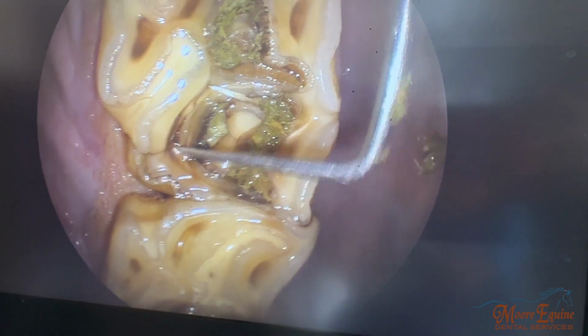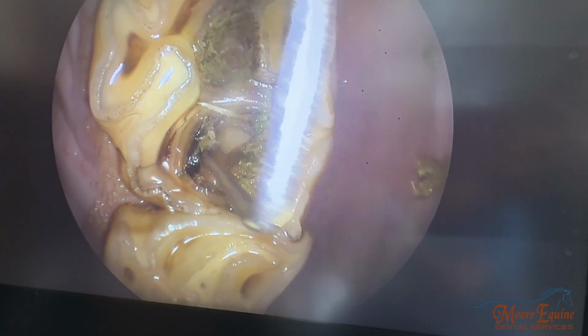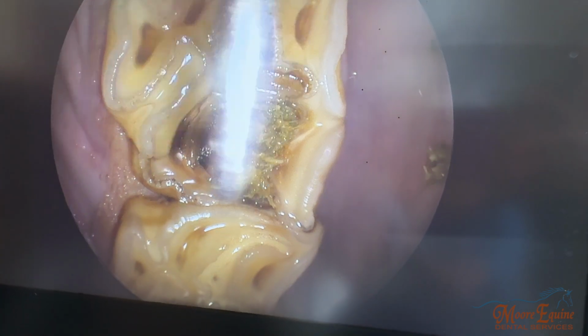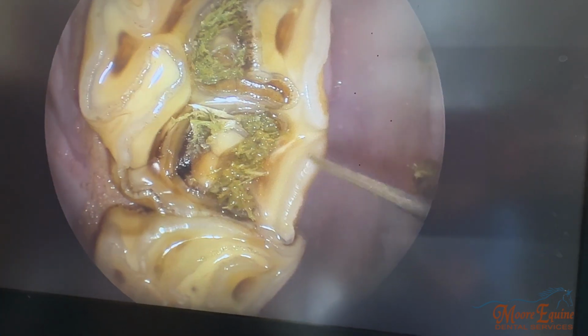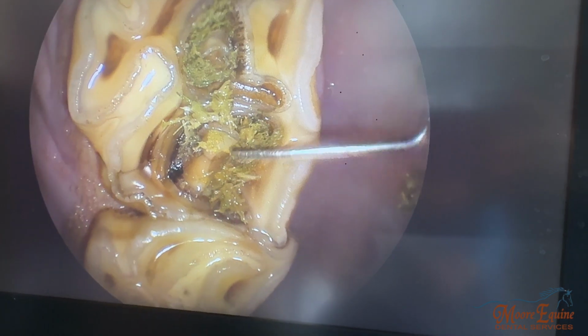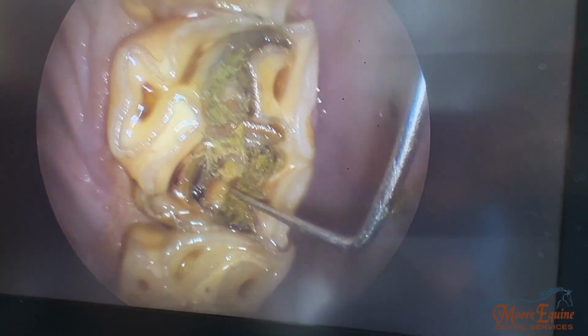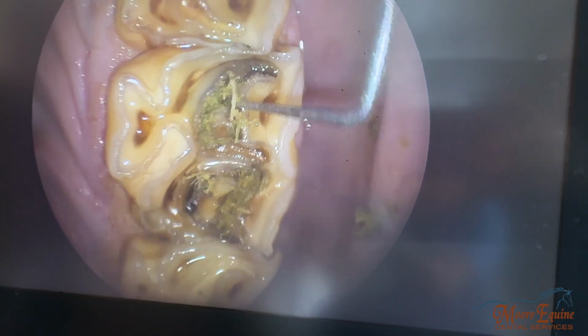So we'll start to clean this out and you'll see that we actually have movement here. And this little piece of tooth will come out. So what we're going to do is clean all of this out using different files and high-speed drills. And then we're going to fill this tooth with composite and rebuild it.